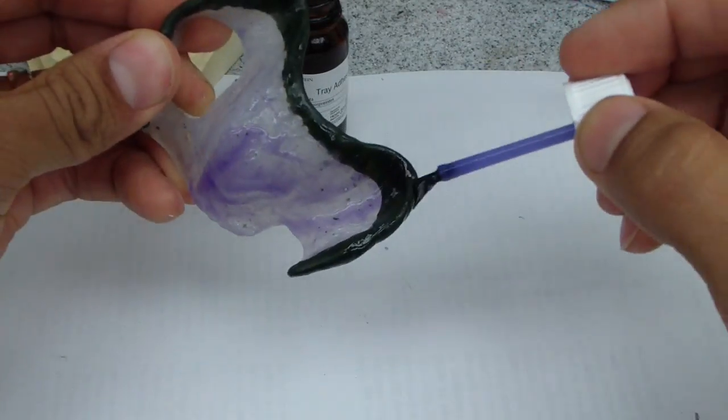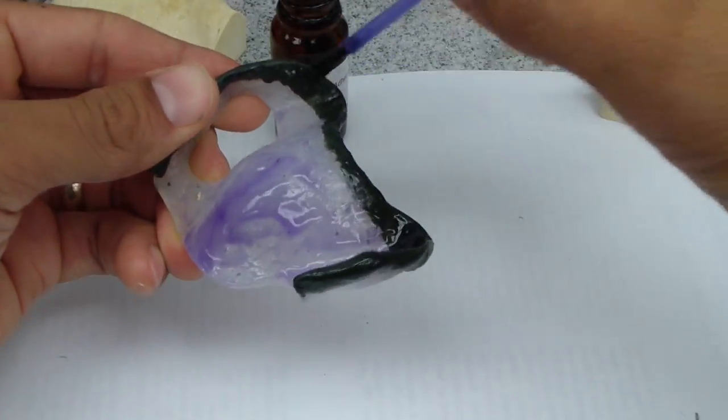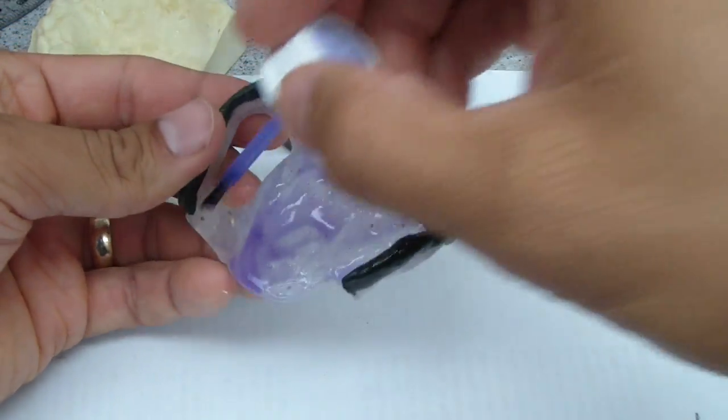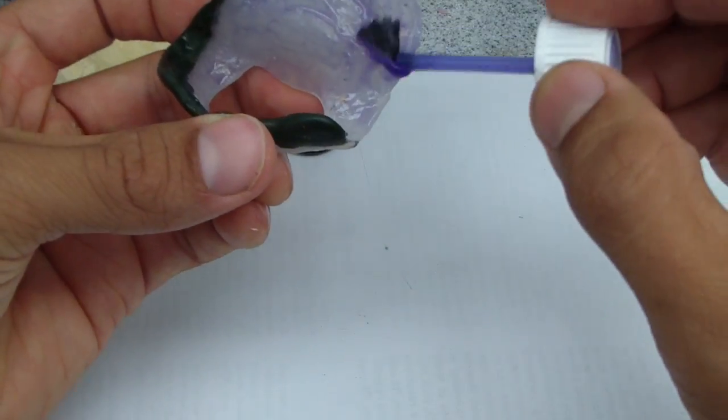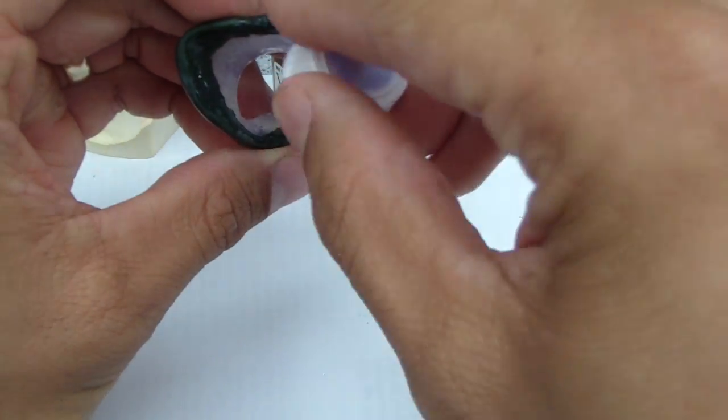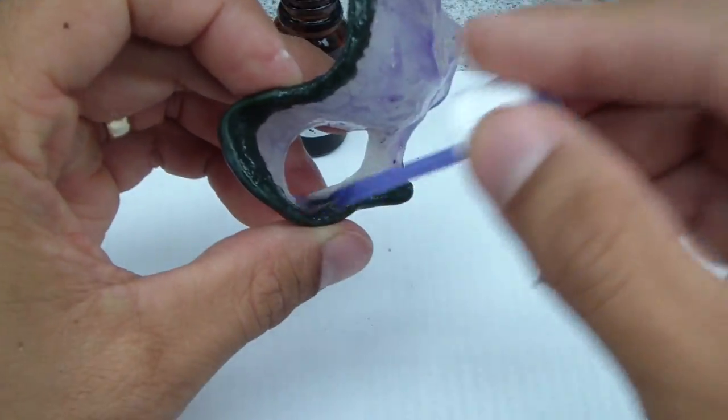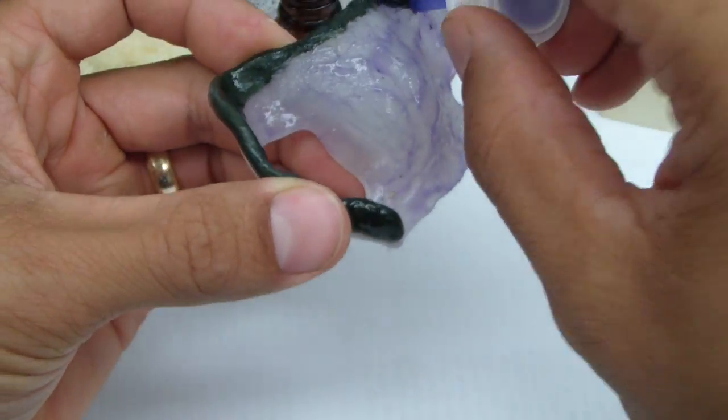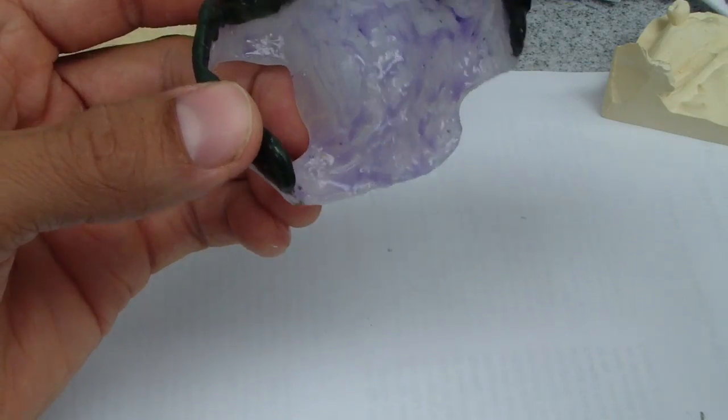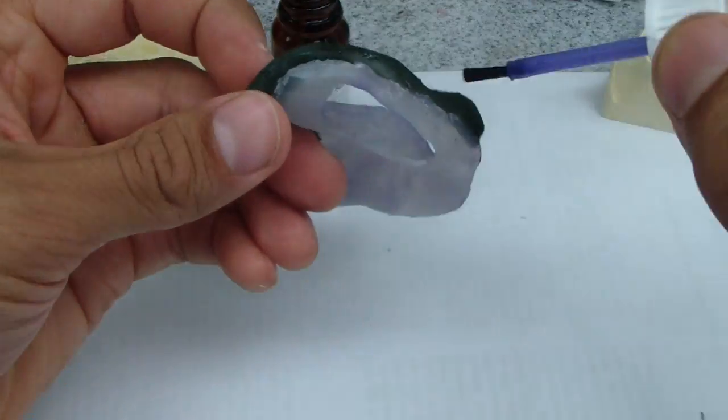So again, this is a sectional impression technique, border molding with a custom tray, and then we'll pick up with a wash, a reline with a light body vinyl polysiloxane or polyvinyl polysiloxane, and then we'll pick up with an alginate.